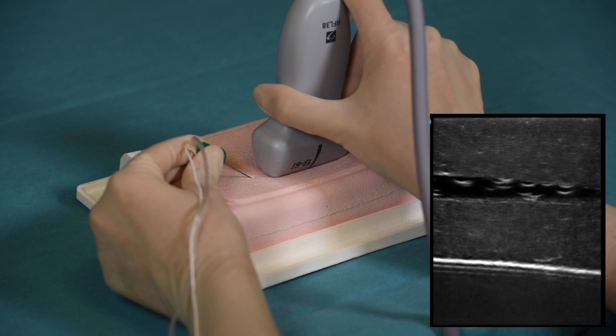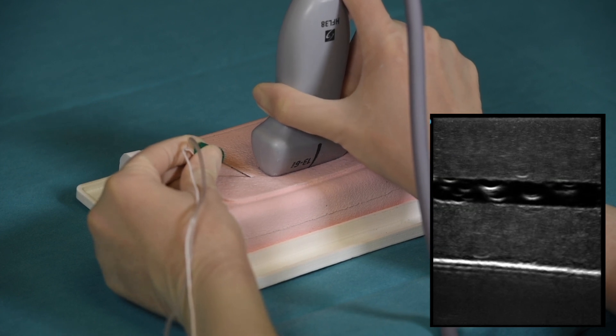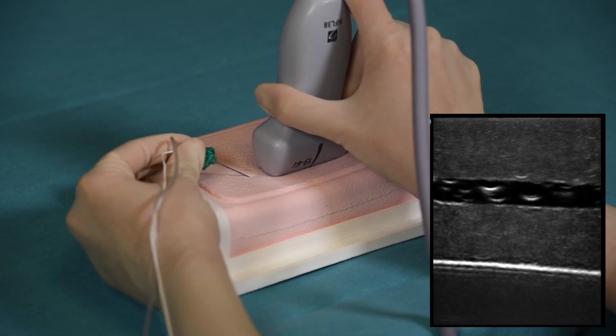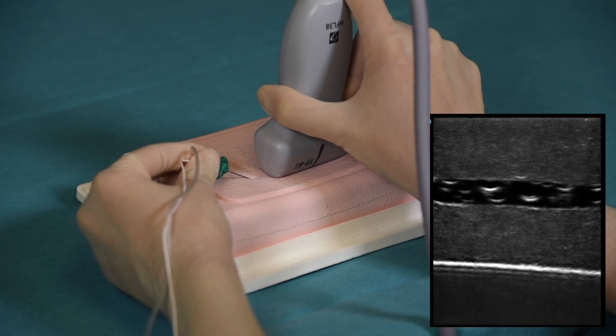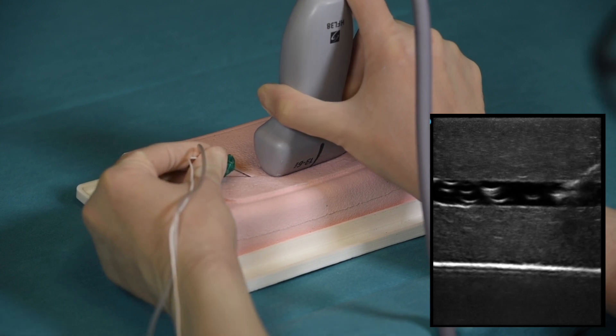As the needle advances deeper into the tissue, its entrance into the blood vessel is seen as it would be in actual patients in whom we would be trying to accomplish intravascular access.